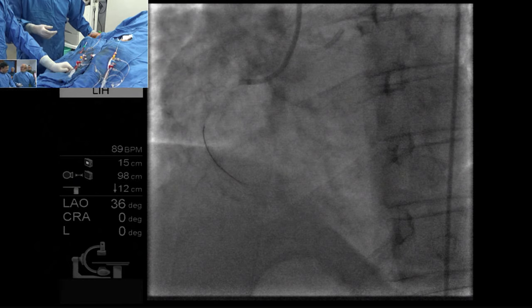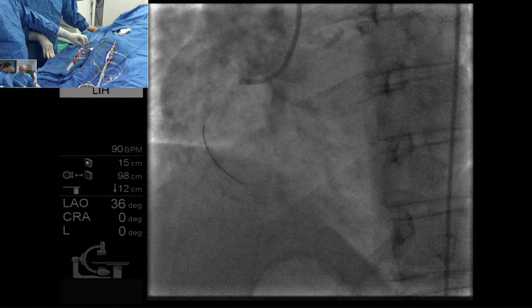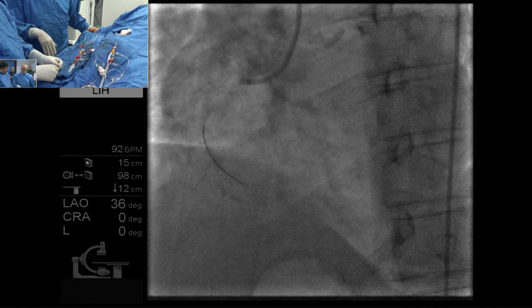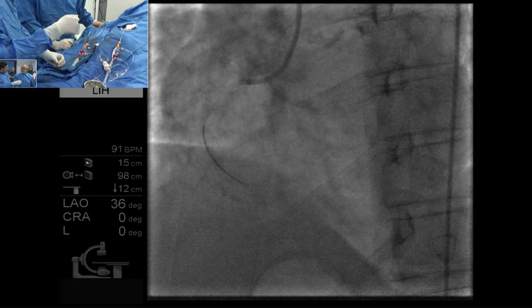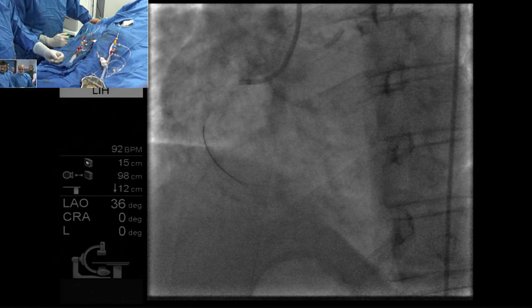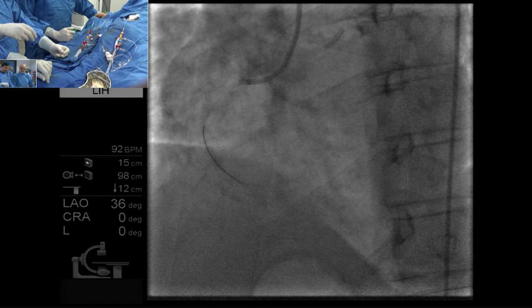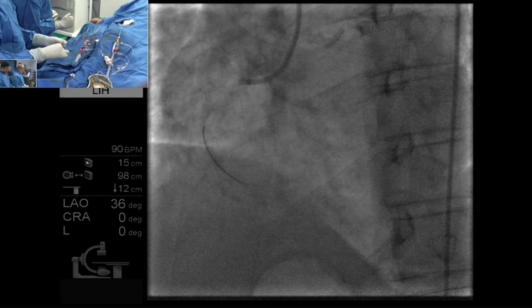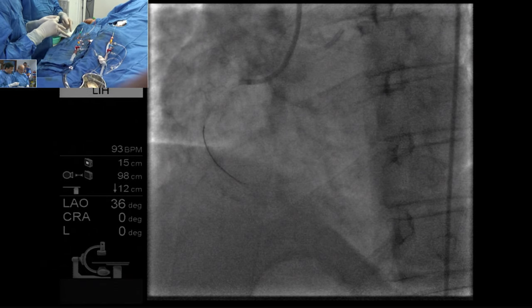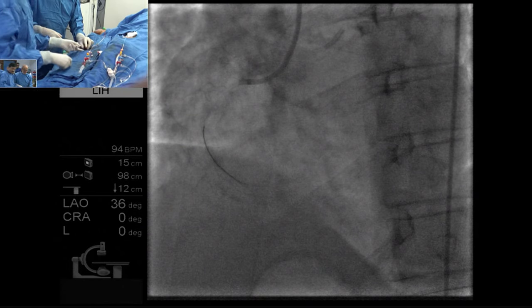Okay, that's not a bad idea. No, microcatheter. Let us try with the microcatheter. The wire may come out when the microcatheter is pulled. We have to insert another. Yes, Tejas. You did the predilation. Don't you think that maybe you can try to advance the microcatheter again? That's what I'm doing. That is what I am doing.